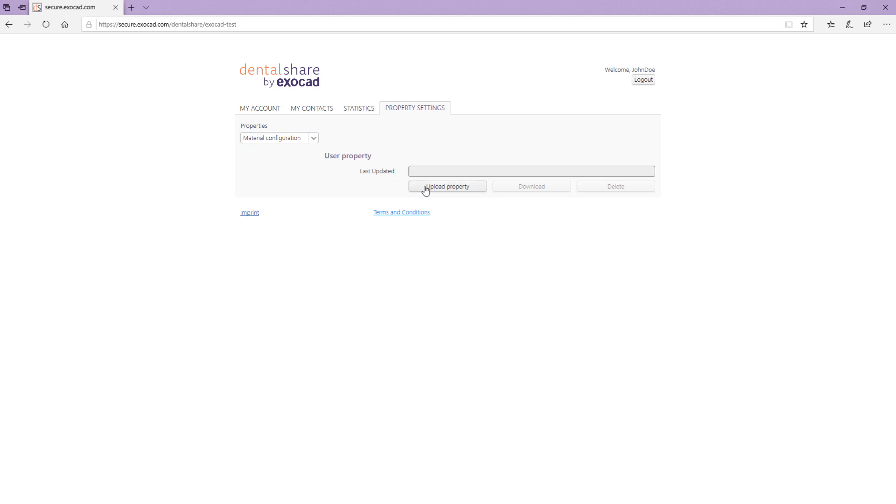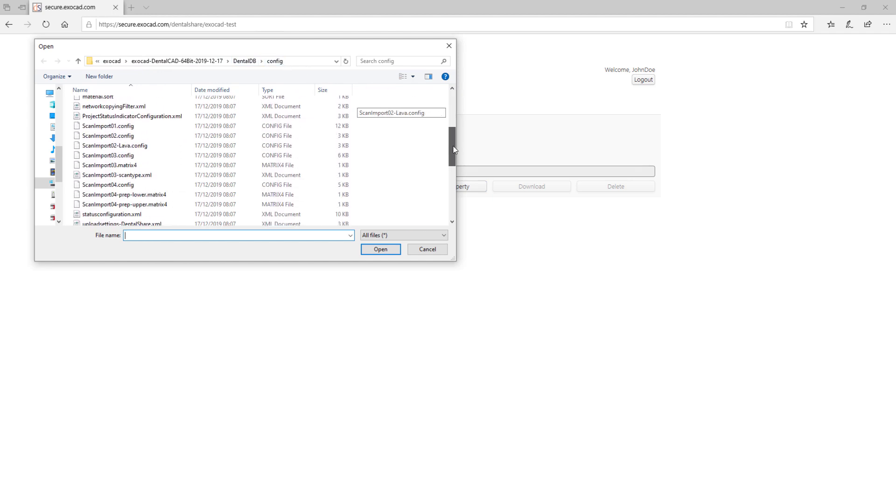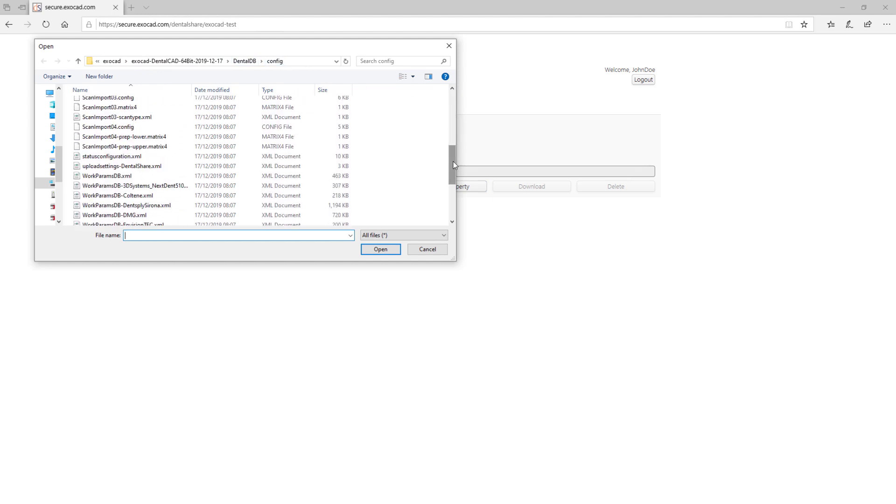Click Upload Property. Navigate to your DentalDB installation directory and select the folder Config. Select the file WorkParamsDB.xml where you have specified your material list.